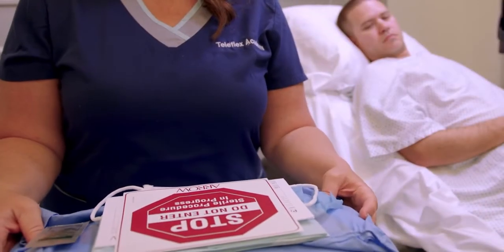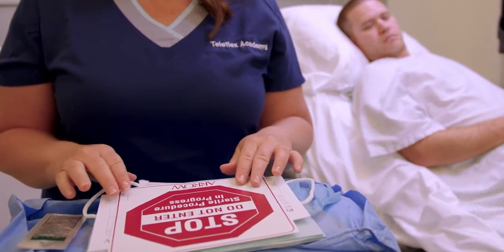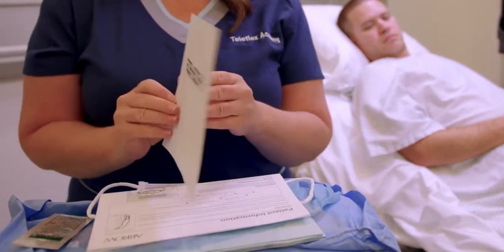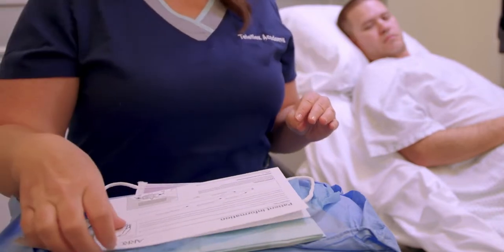Place the insertion tray on the procedural table and open the pouch on the outside of the procedure tray if present. The insertion tray shown contains a stop sign designed to be placed on the door to indicate that a sterile procedure is being performed.